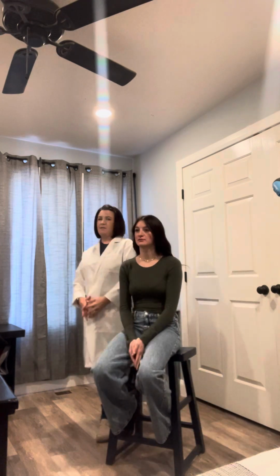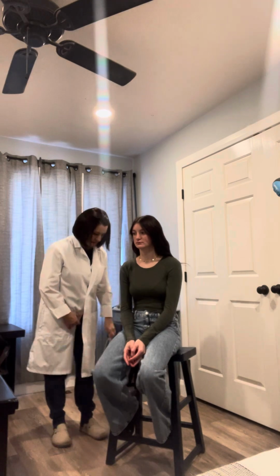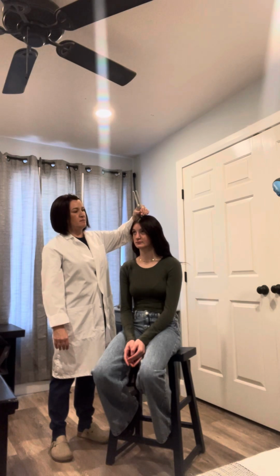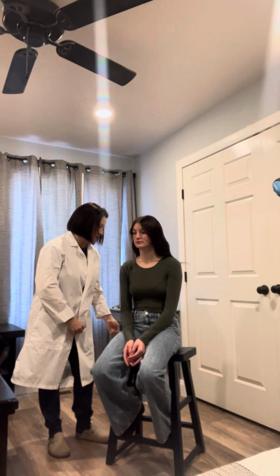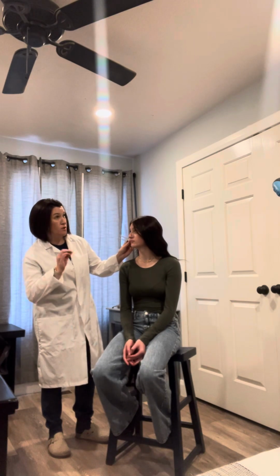Okay, good. Then we're going to do the Weber test. So I have my tuning fork. I'm going to activate my tuning fork. Do you feel it symmetrically down both sides, or hear it symmetrically? Yeah. Good. Okay, now I'm going to do the Rinne test. So again, I'm going to activate my tuning fork. I'm going to place it on your mastoid bone. Tell me when you're no longer hearing it. Okay.